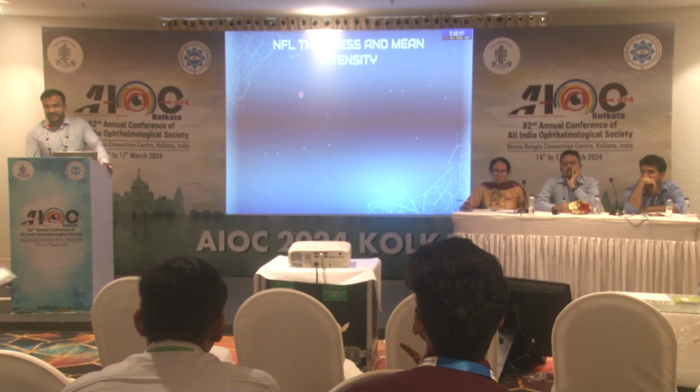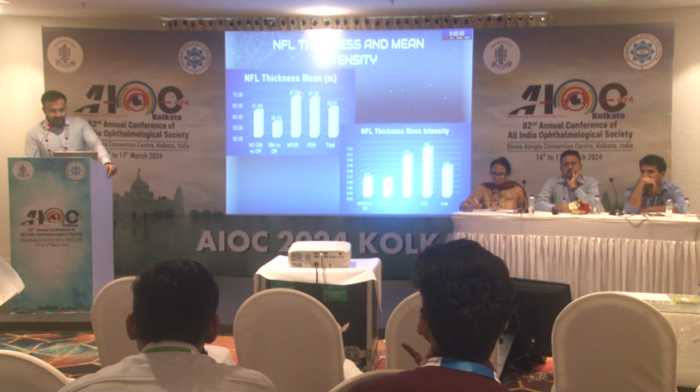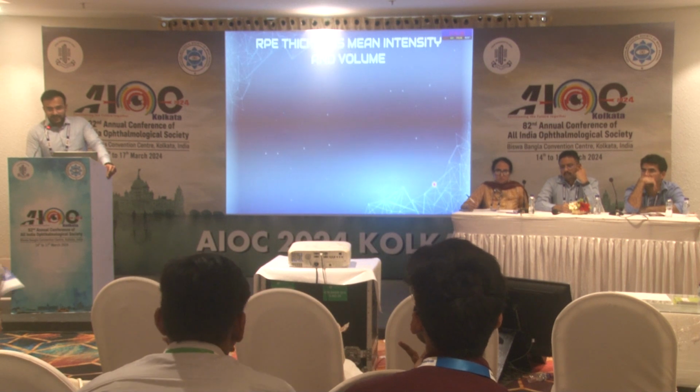All these results were statistically very significant, whereas when we measured the NFL thickness mean and the NFL thickness mean intensity, though the values were higher in the NPDR group in the case of NFL thickness mean, and higher in the PDR group for intensity, these were not significant when we did the analysis.